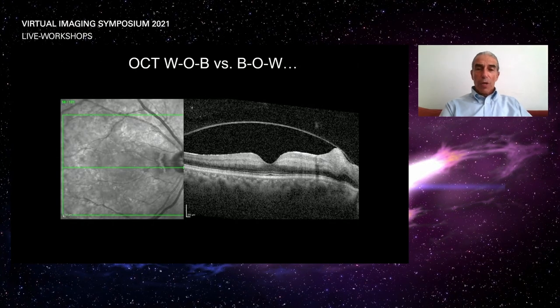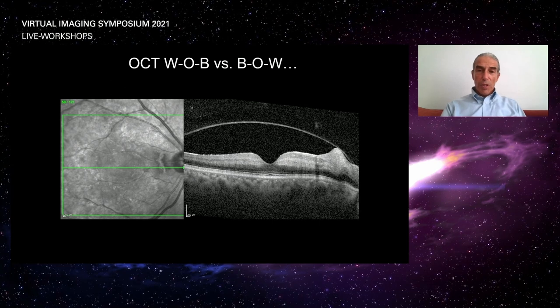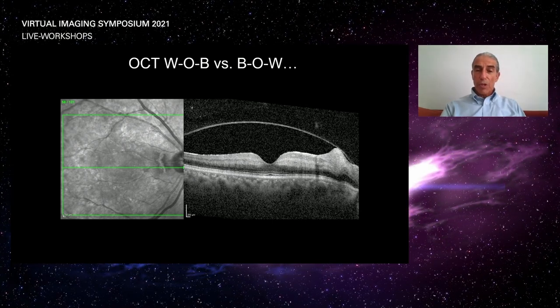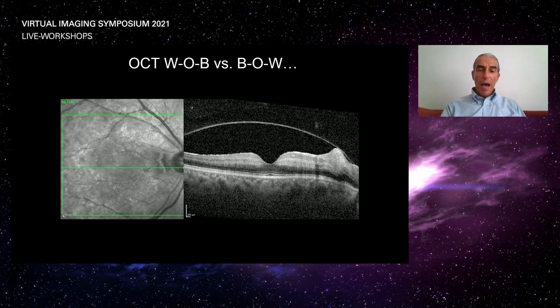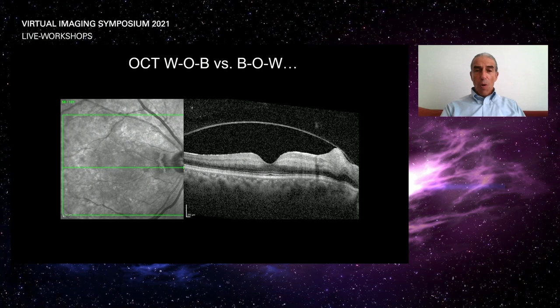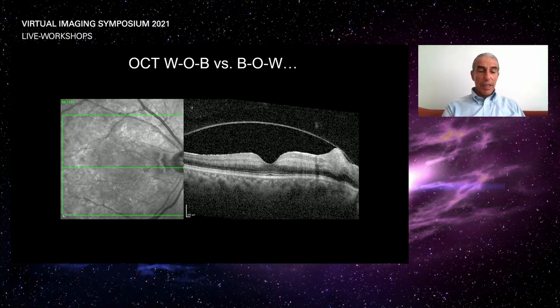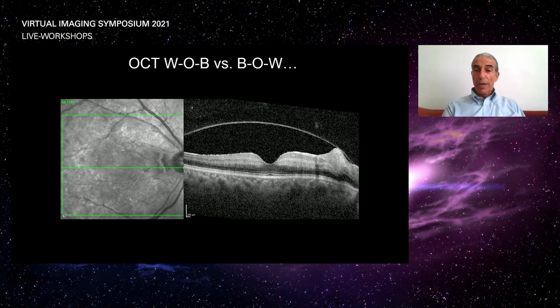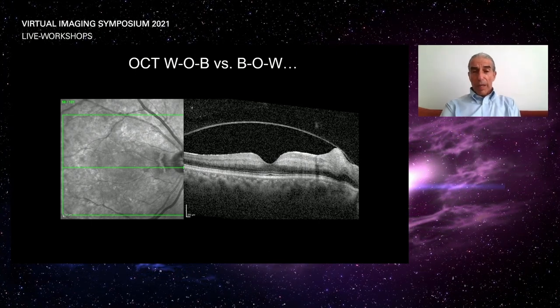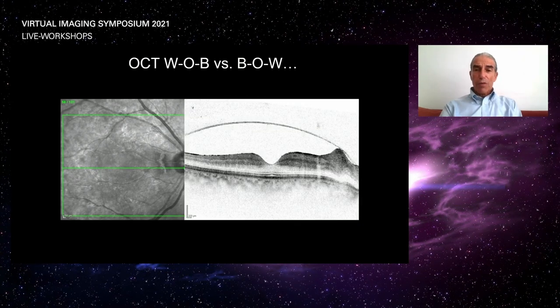What I'd like to show you is how we arrive at the diagnosis. Without fluorescein angiography, this could have been tricky. Here is what most people use as a single scan outside of a map. And I think we would all agree there's nothing really dramatic here. In the single OCT scan, I'm not looking at the map or the thickness, just the single scan. And unfortunately, many places make do with this. But what happens when you reverse the color?